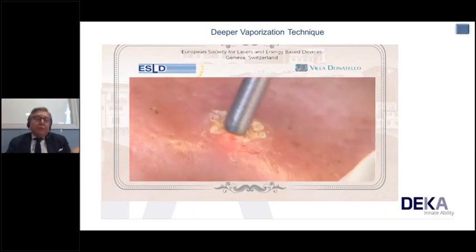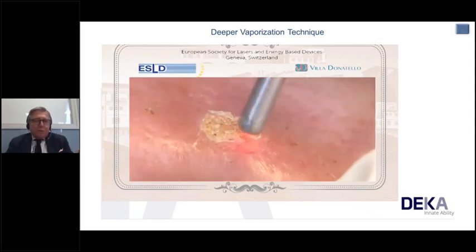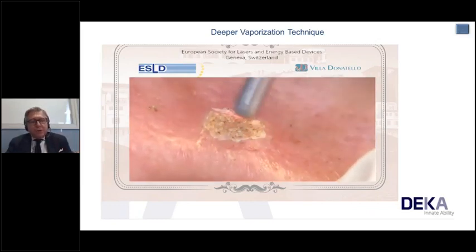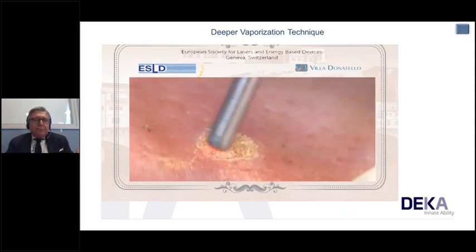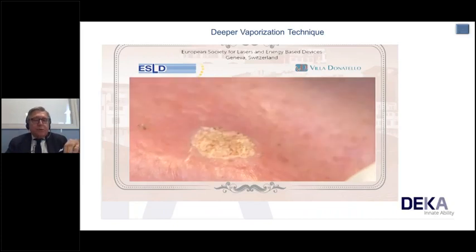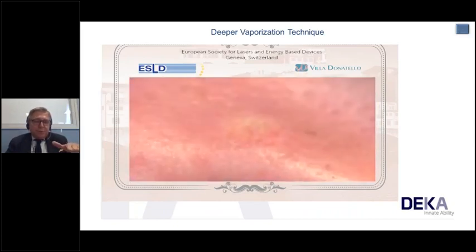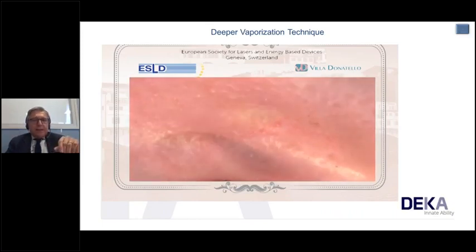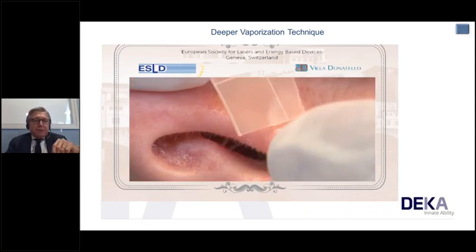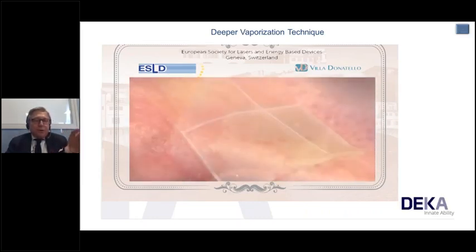It's very important even to understand the endpoint. It is one of the most important problems, when to stop our procedure. And if you note in the lateral view, side view, you can see that you have a very modest depression of the skin that you can see here. We have to get this result, this endpoint. We cover sometimes with a sort of hydrocolloid dressing.